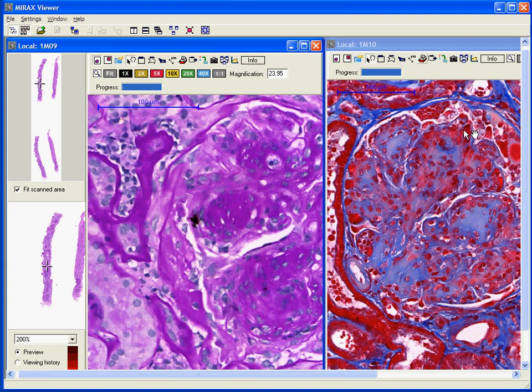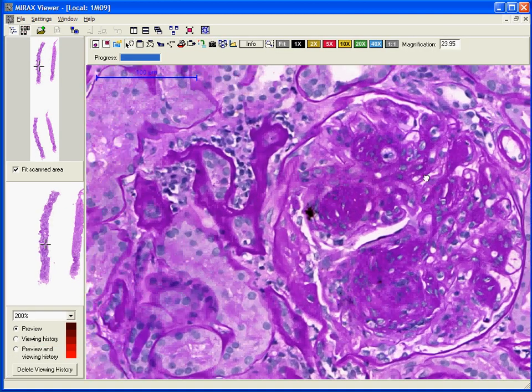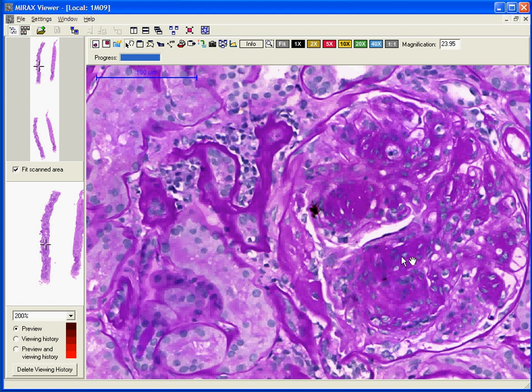Another stain used in renal biopsy is the trichrome stain, which stains fibrosis in the interstitium and sclerosis in the glomeruli in blue. These nodules stain blue with Masson's trichrome stain. These nodular lesions can be observed in diabetic nephropathy, and their name is Kimmelstiel-Wilson lesions, first described by Kimmelstiel and Wilson in 1936.